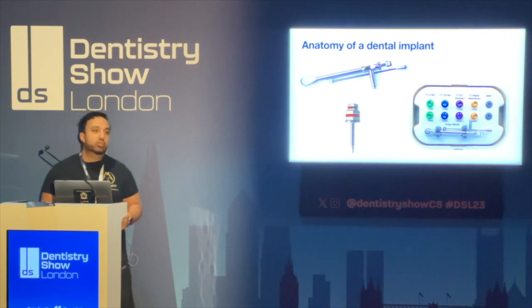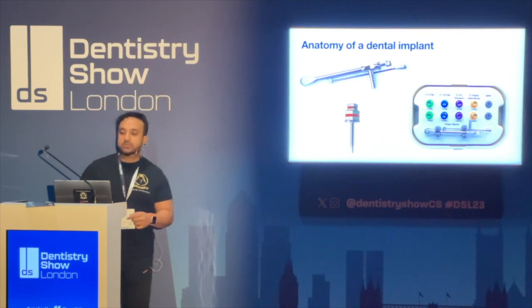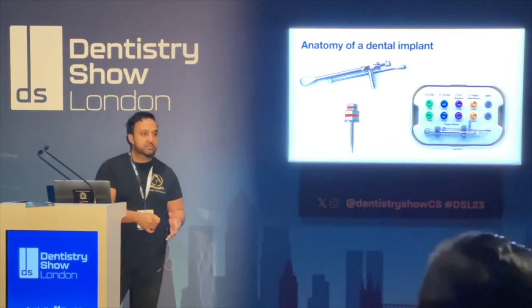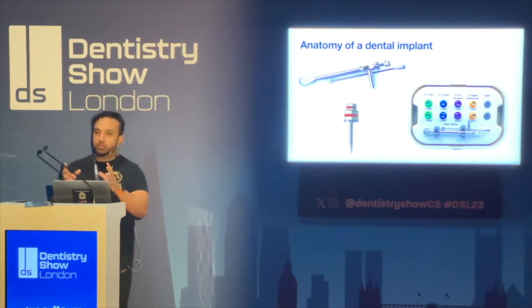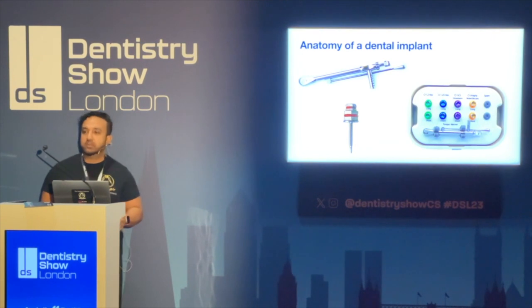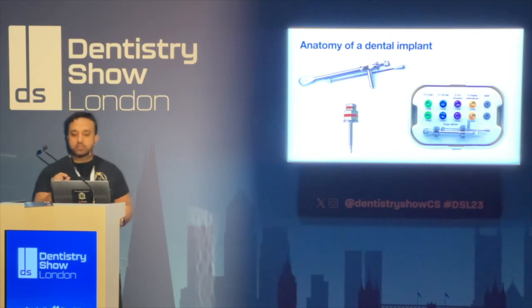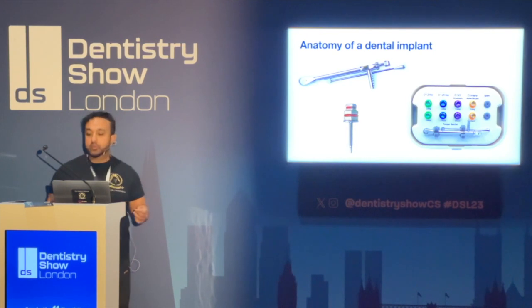Now every general practice should have one of these kits. This is a kit that has what we call hex drivers. They're like little keys that go into the implants. Even if you don't know the implant manufacturer, if you have this universal kit, you can mostly fit 99% of implants that come through your door to tighten them up. The drivers themselves are measured in the actual sizes of the hex at the end of them. As you can see here, we have a 1.2, which is the most common, and a 1.25.